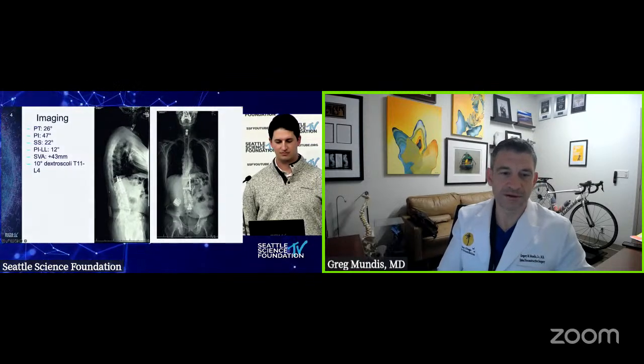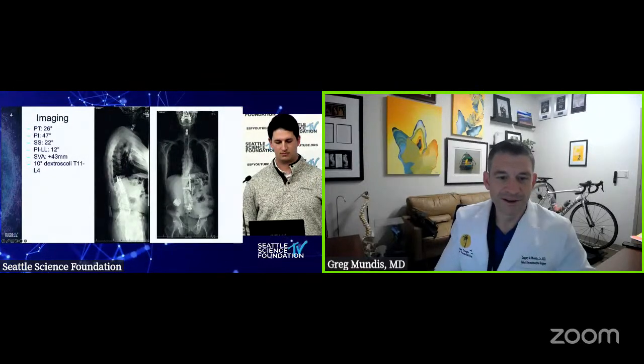So that tells me he's starting to decompensate a little bit. So you add all that together and you're like, all right, there's definitely a mild deformity that's lurking there. And if I decide to reconstruct, it certainly could have an impact on what's happening down the road. Another interesting thing, it'd be fun to see what an x-ray looked like prior to the spinal cord stimulator. It looks like he's starting to get a little kyphotic above where the anterior surgery was.